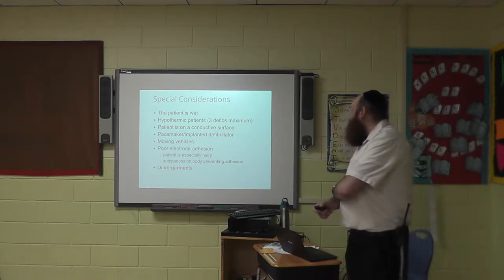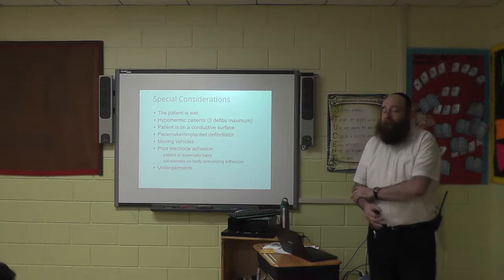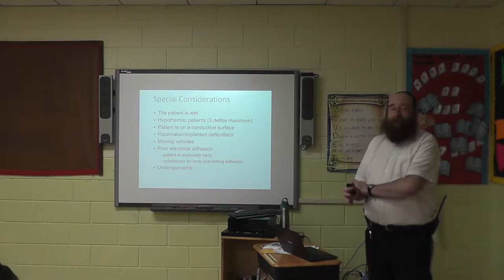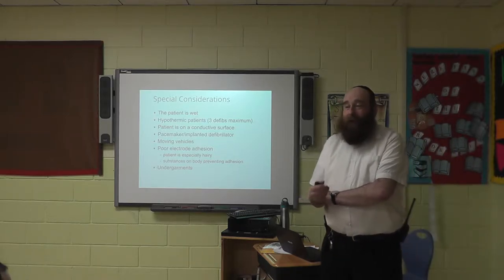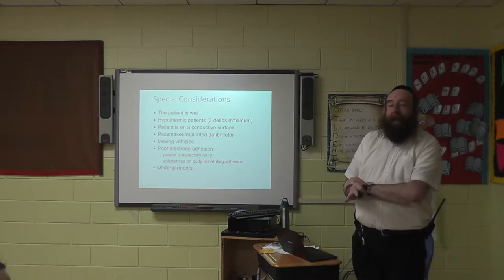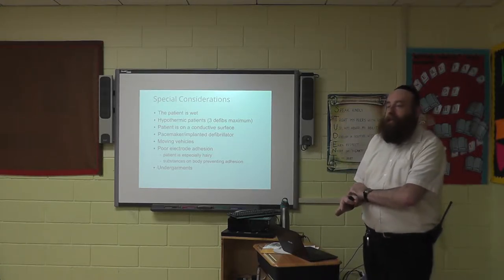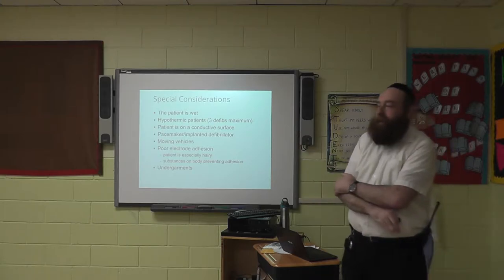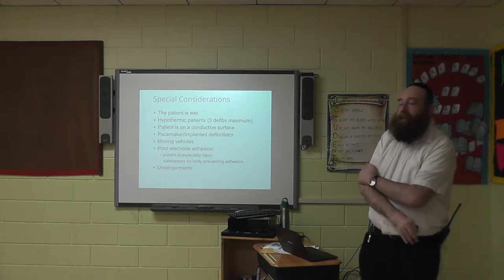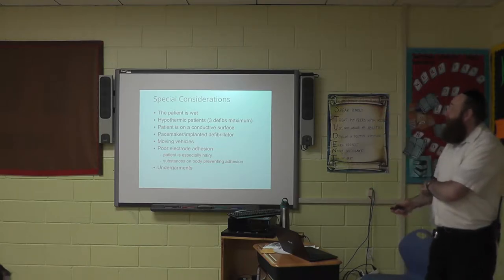Poor electrode adhesion. One of the biggest problems we have is with a hairy chest, in men also. And there are really 2 options. A lot of us carry portable razors, which there's really no time for. What I do is what I call the $80 waxing. A set of pads costs about $80. You place the pads where you want them to be. You rip them off, and then put a new pair of pads in the places. Yes, $80 waxing, I call it.